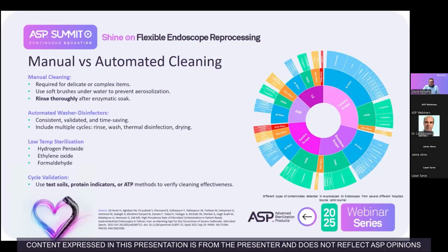Another emerging trend is that there's a new option in the guidelines where an endoscope manufacturer has developed a novel approach to endoscope reprocessing. The system provides endoscope inspection, they do the microbiological testing, they do the high-level disinfection, and they sterilise with ethylene oxide. These endoscopes are then dispatched to endoscopy units throughout the country in sealed sterile bags, together with the microbiological reports, ready for immediate patient use. They also claim that when stored in their sterile bags, the endoscopes have a shelf life of 18 months.